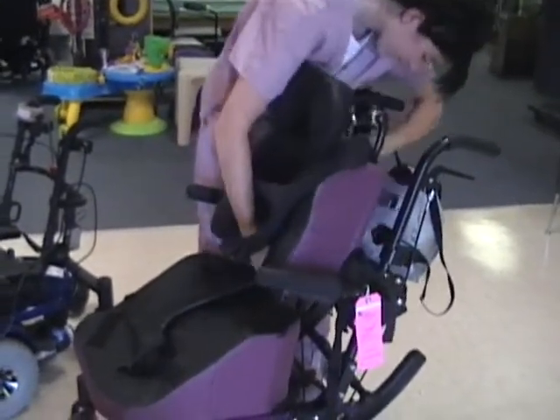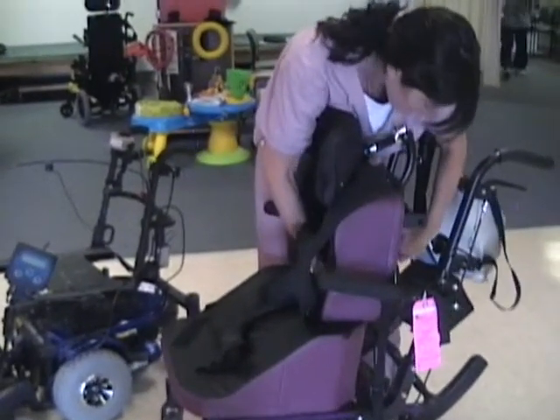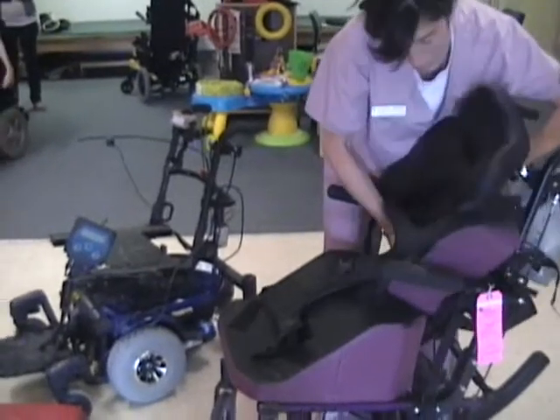Victoria is taking off the seating system that's on the manual chair, which will then be placed onto the power chair that Ariana is testing in.